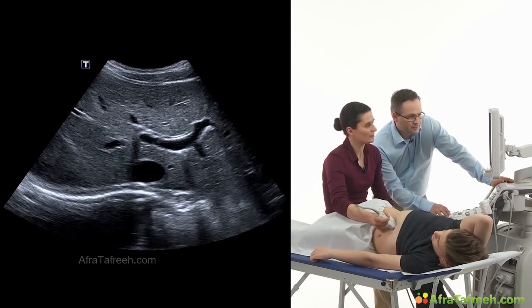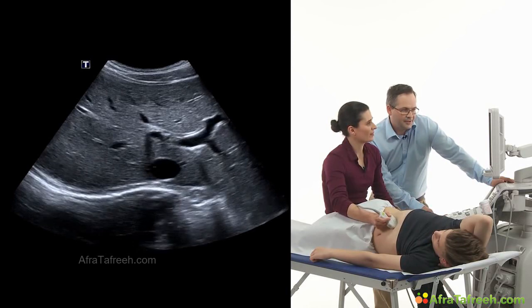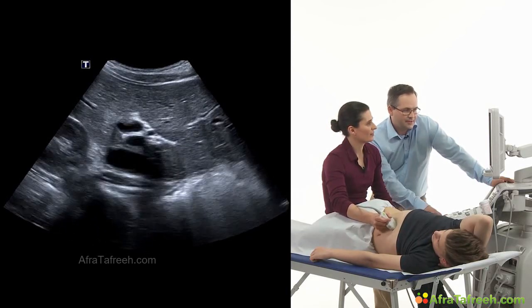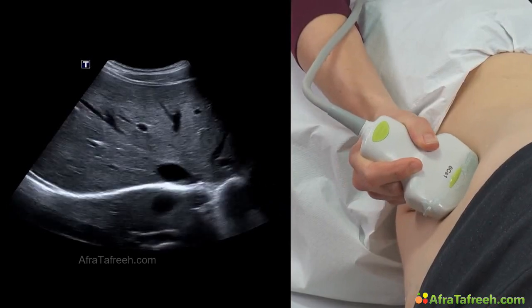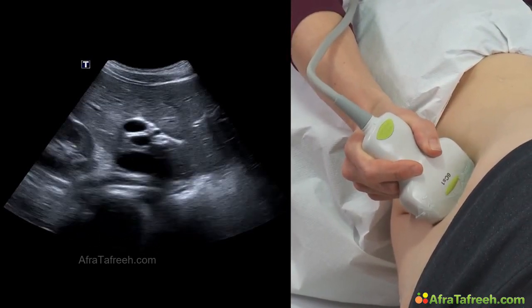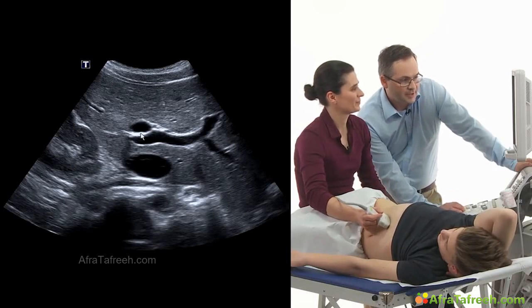Please inhale again. And here we can even see the tail. There's something, yes, over here. The gallbladder is coming into our view over here. Great, so you managed also to see the gallbladder at the back of the jumping deer over here.